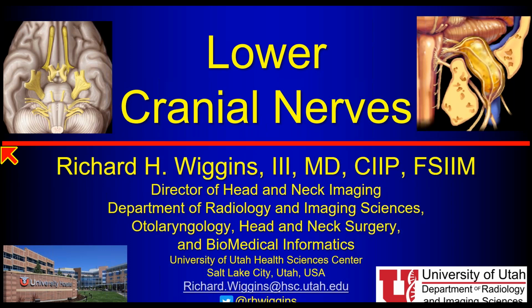Rick, while we're waiting, what are your basic sequences that you would use if a patient presents with a complex lower neuropathy or isolated neuropathy? What are the basic sequences on MR? On MRI, I want to do an axial and a coronal T1. So I get an axial and a coronal T1 without fat saturation. Do not do fat saturation on your pre-contrasted imaging. It's a waste of time.